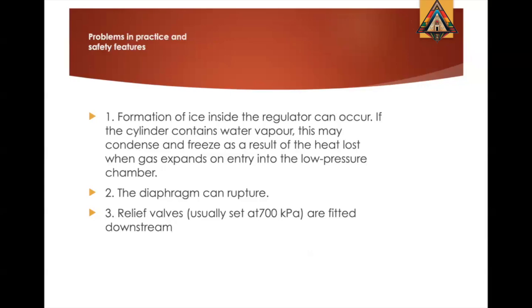700 kilopascal fitted downstream. So in case the diaphragm ruptures or there is any malfunction causing a pressure higher than 400 kilopascal, we have another safety relief valve downstream to relieve the extra pressure at 700 kilopascal.